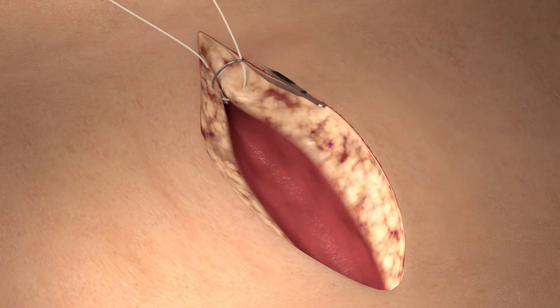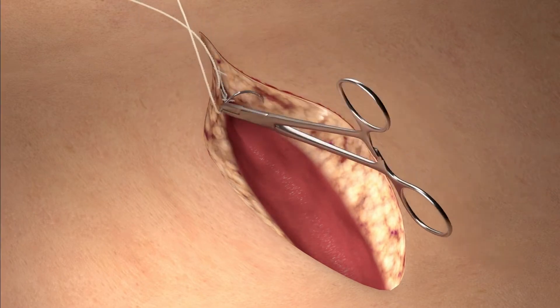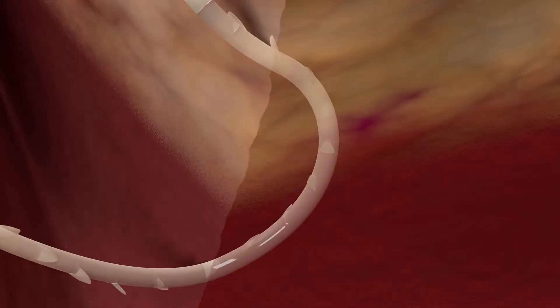Now the device can be grasped and the tissue can be approximated to the desired tension. This helps anchor the Quill device and ensures even distribution of tension.